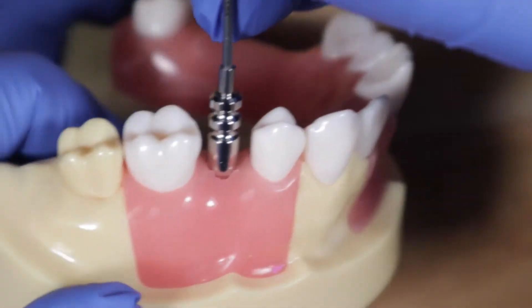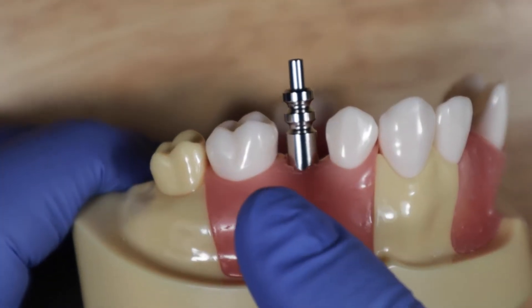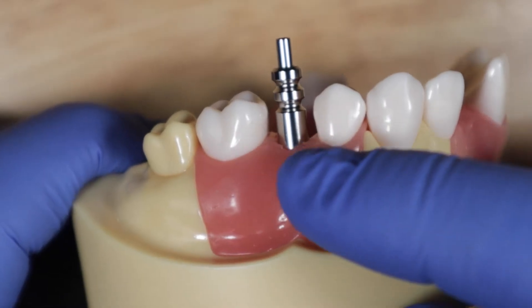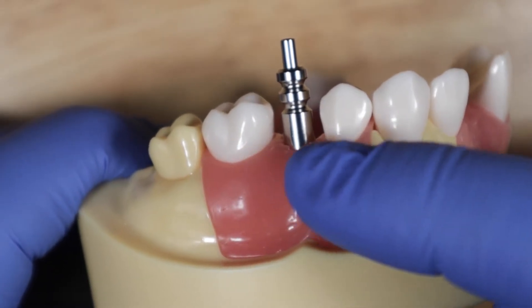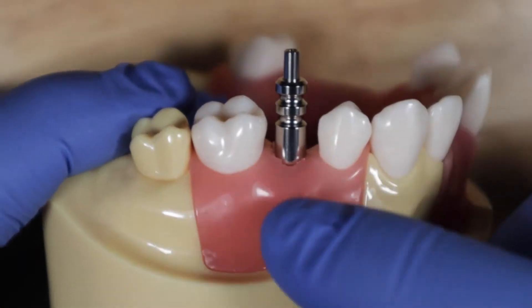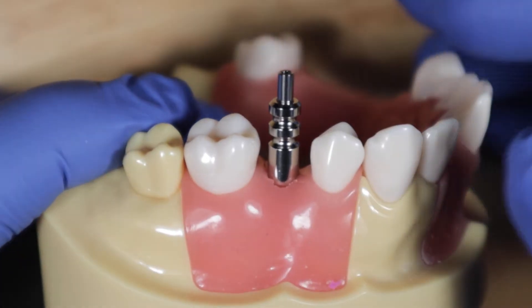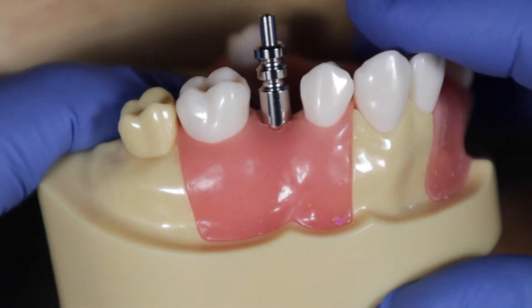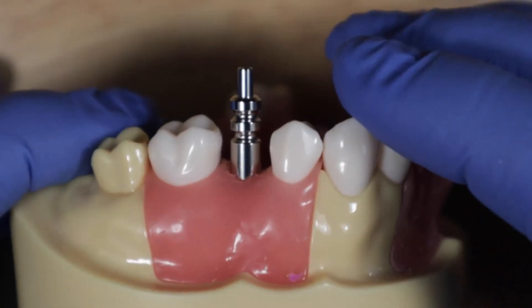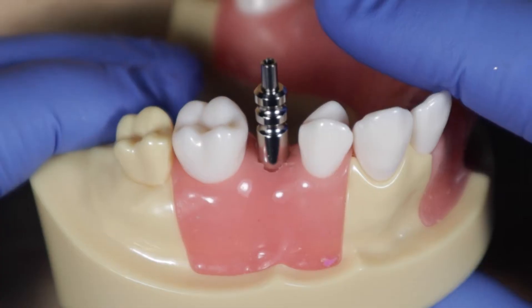At this point you can take a radiograph. Taking a bite-wing radiograph will show you that the platform is fully seated. With internal hex implants and components you can pretty much feel that it's on right — you don't necessarily have to take an x-ray — but that's always a good idea. Once your x-ray confirms it's seated well, you move on.